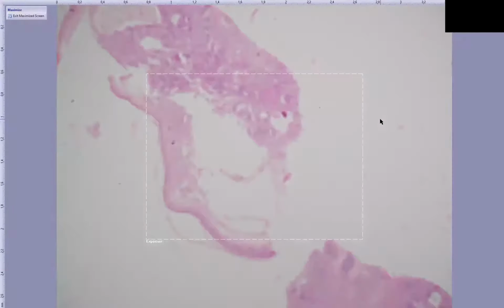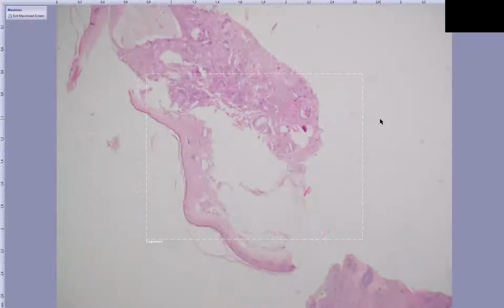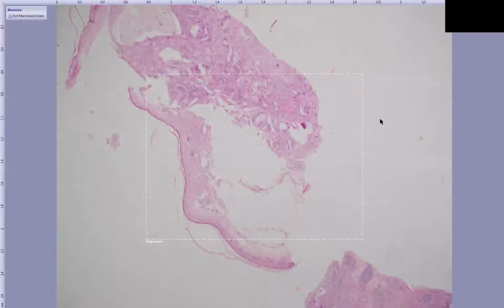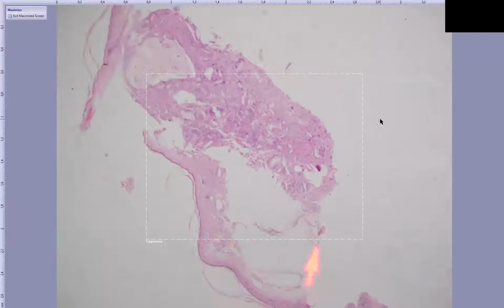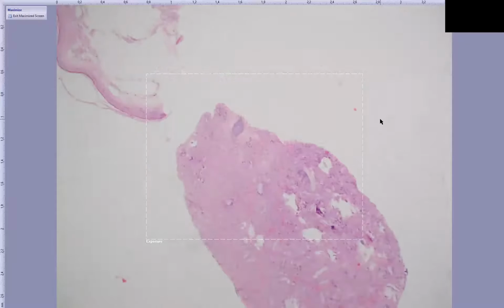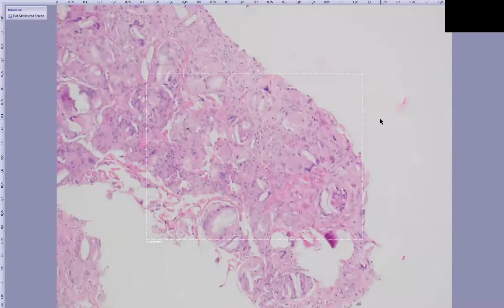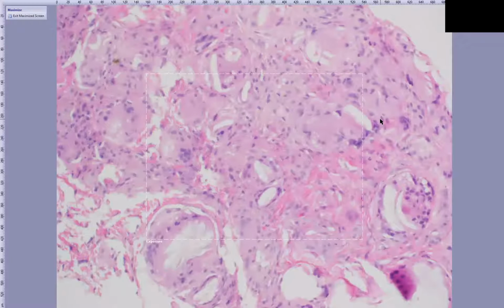Another type of foreign body granuloma that's also common is this one here. So we have epidermis here on top, and we have a diffuse infiltrate in the dermis, filling the dermis. And it's comprised of multiple multinucleated giant cells, varying sizes, and epithelioid histiocytes, but mostly giant cells.